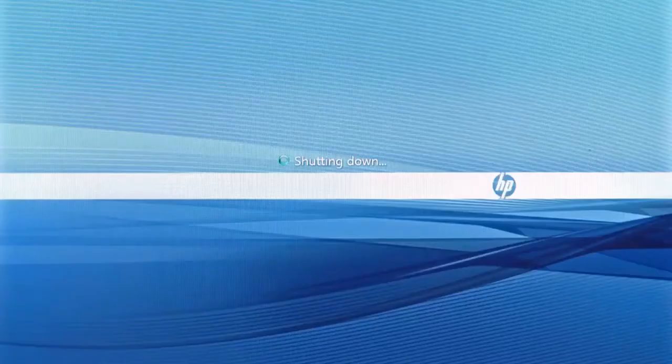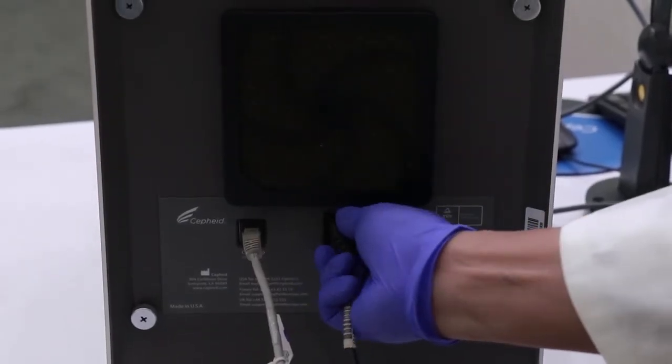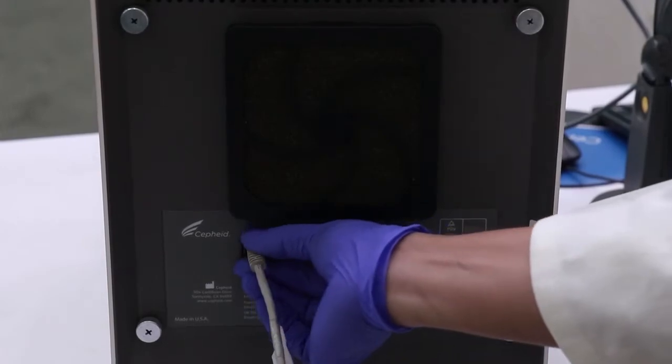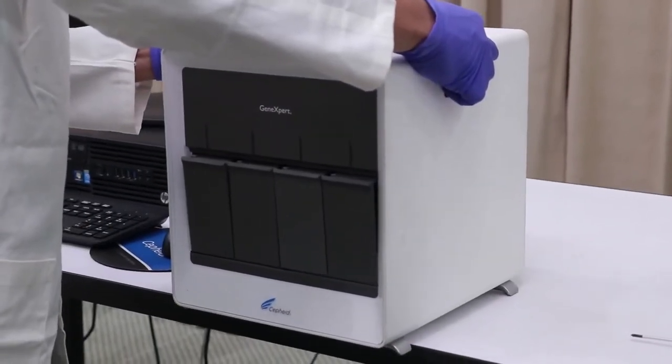After that, shut down the computer, switch off the GX machine, and unplug the power cable and network cable. Place the machine on the edge of the table carefully.